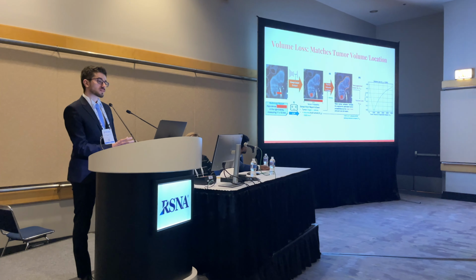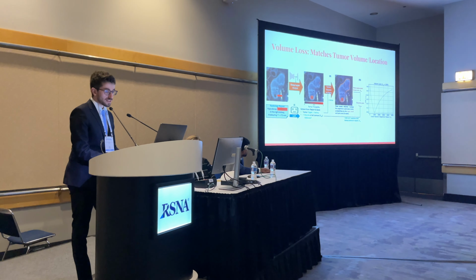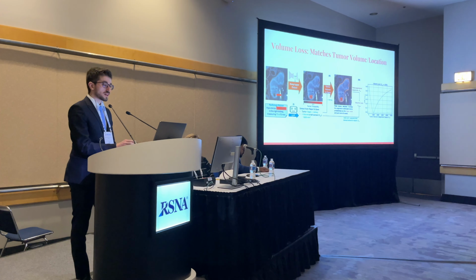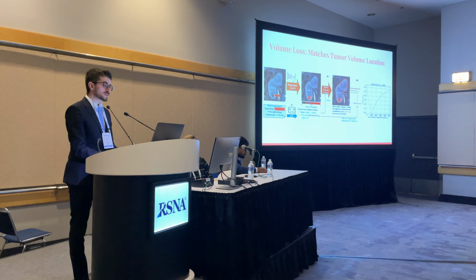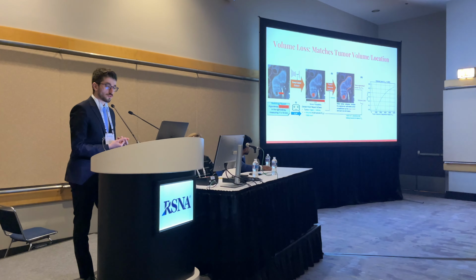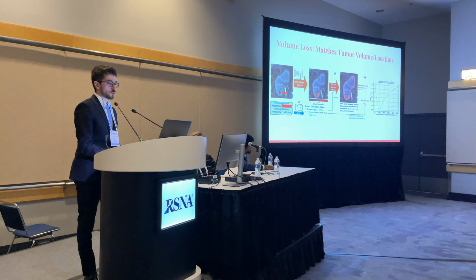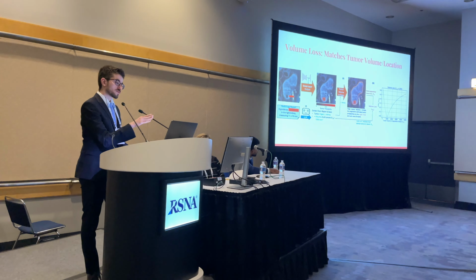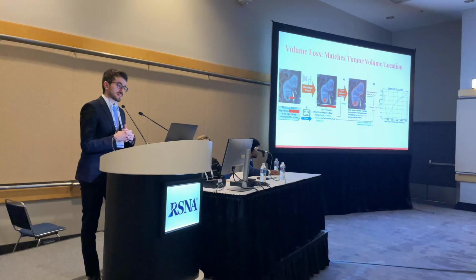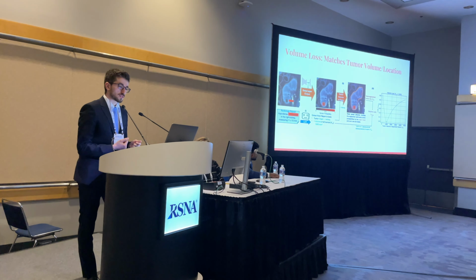Then we also estimate it from the segmentation. So we use a pre-saved organ mask, like TotalSegmentator masks, to find the organ that has tumors, and then inside this organ, we estimate the segmented tumor volume, which is basically counting voxels and considering the voxel volume. Then we have a loss function that makes the estimated segmented tumor volume match the volume estimated from the reports.